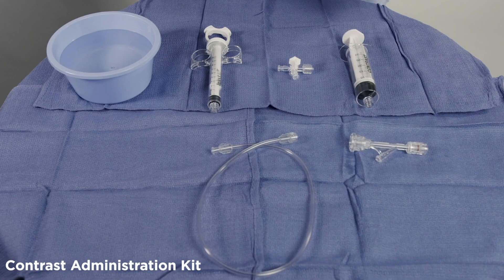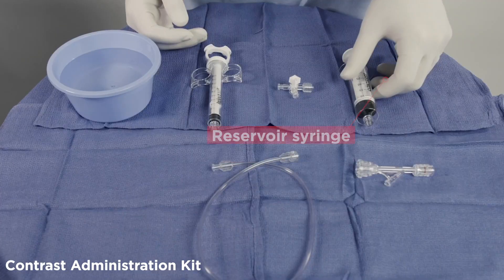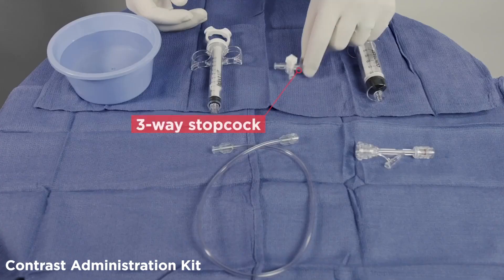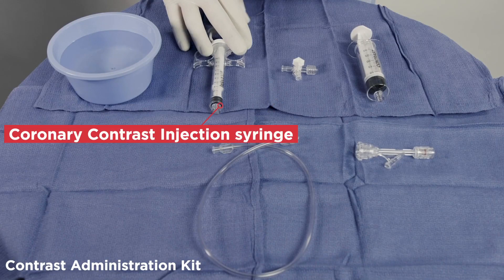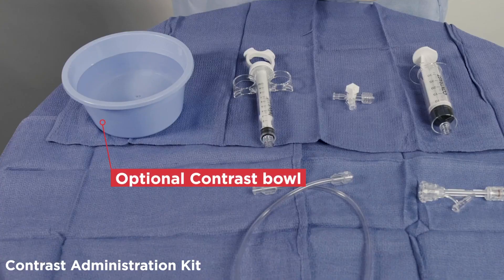The contrast administration kit is a dedicated contrast injection system allowing for better visualization of the anatomy for catheter manipulation. The kit includes clear high-pressure tubing, a hemostatic valve, a reservoir syringe, a three-way stopcock, a coronary contrast injection syringe, and an optional contrast bowl.